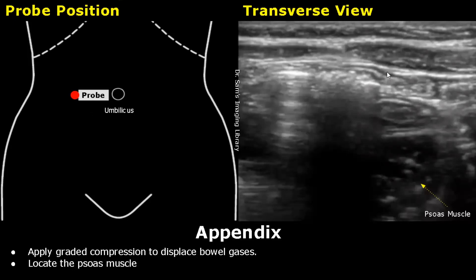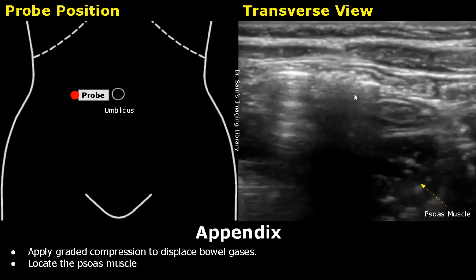Locate the psoas muscle by keeping the probe in this manner. Here you will find the psoas muscle. This is the dirty shadowing due to bowel gases, and you can also see some bowel loops.